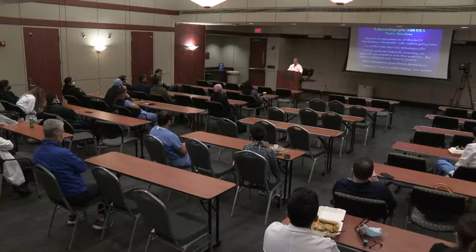Thrombolysis, Tom Porter actually has pioneered this, in helping on the way to a PCI procedure, an acute myocardial infarction, because the high energy combined with contrast can enhance thrombolysis. And there are some experiments regarding vasa vasorum imaging when you have high-risk soft plaque, I think still experimental, if you will.